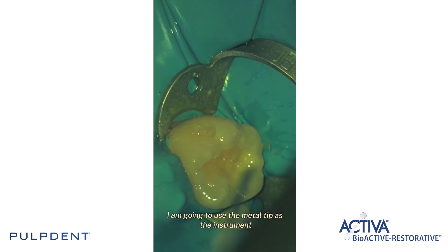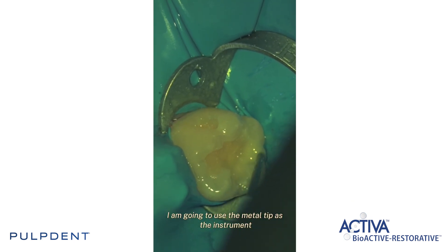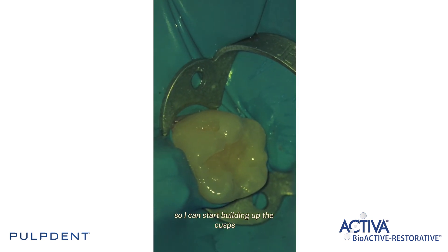When this is done I am going to use the metal tip as the instrument so I can start building up the cusps.